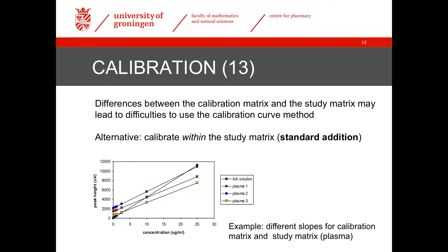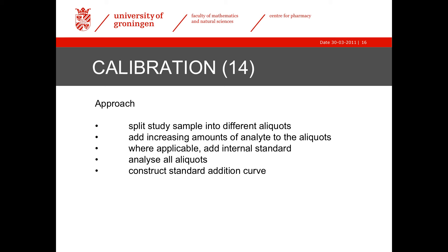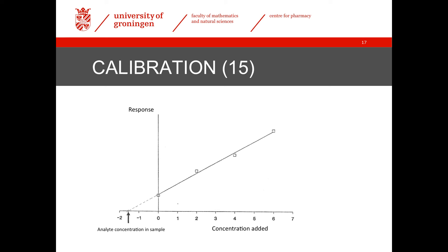Here is an example of such a situation. For an endogenous analyte, we had to use an amino acid solution as the proxy matrix, and the slope of the calibration curve in this proxy matrix was quite different from the slopes in plasma. Therefore, we would get incorrect results if we had used this calibration curve for the calculation of plasma concentrations. The solution is to generate a calibration curve in each individual sample by splitting each study sample into different subsamples and preparing calibrators using these different aliquots. In this way, we reconstruct a calibration curve that already contains the analyte when no extra amount is added. The intercept of this curve, therefore, is not equal to zero, and the analyte concentration can be determined from the point where the curve intersects the x-axis.